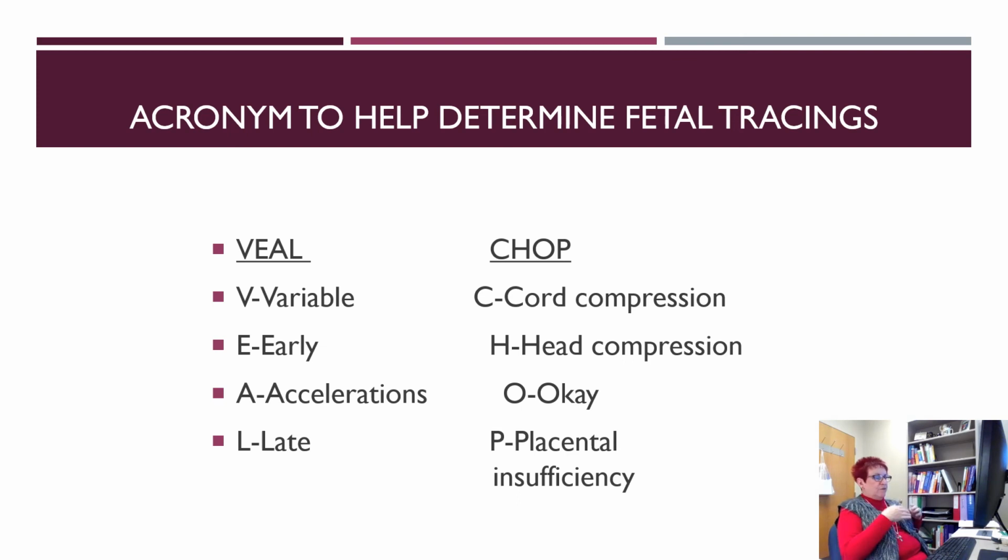This is a very helpful thing I've found that helps people keep track of fetal heart tracings and what they all mean. VEAL CHOP. So there you go. Hope that'll help you.